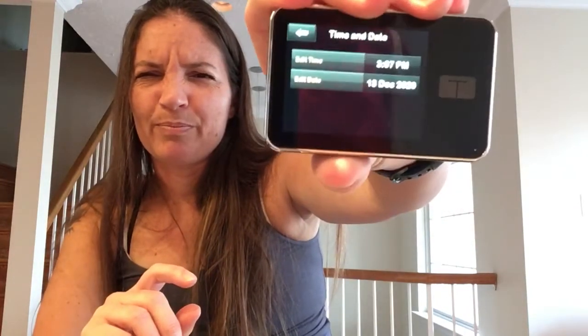Next up is time and date — pretty straightforward stuff. It's your time and your date, and then there's the 12-hour and 24-hour option, but I won't try to give anybody advice on that because it takes me a couple times every time.